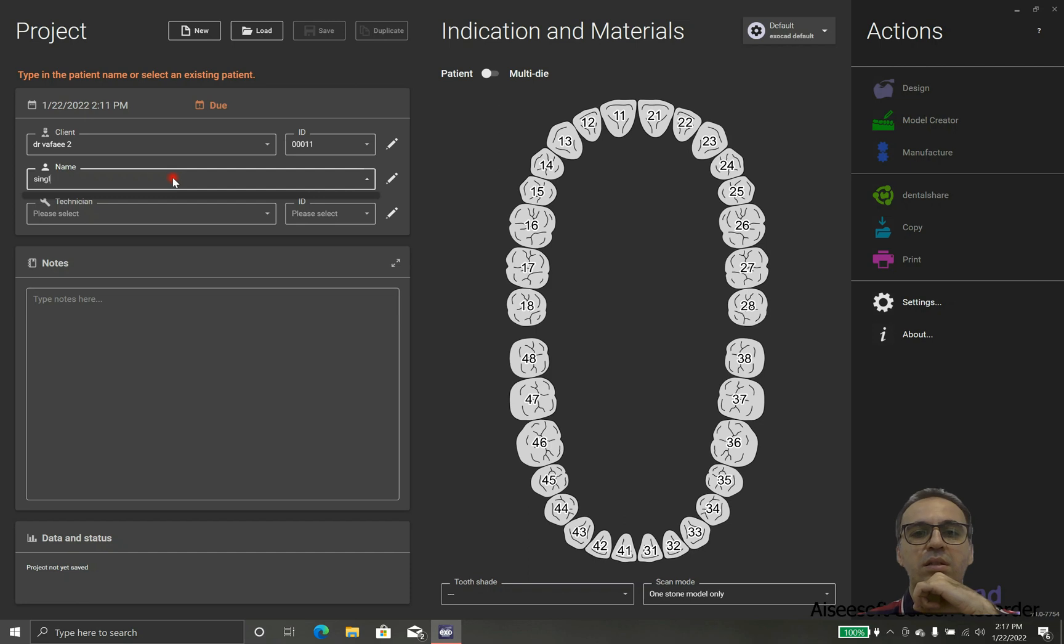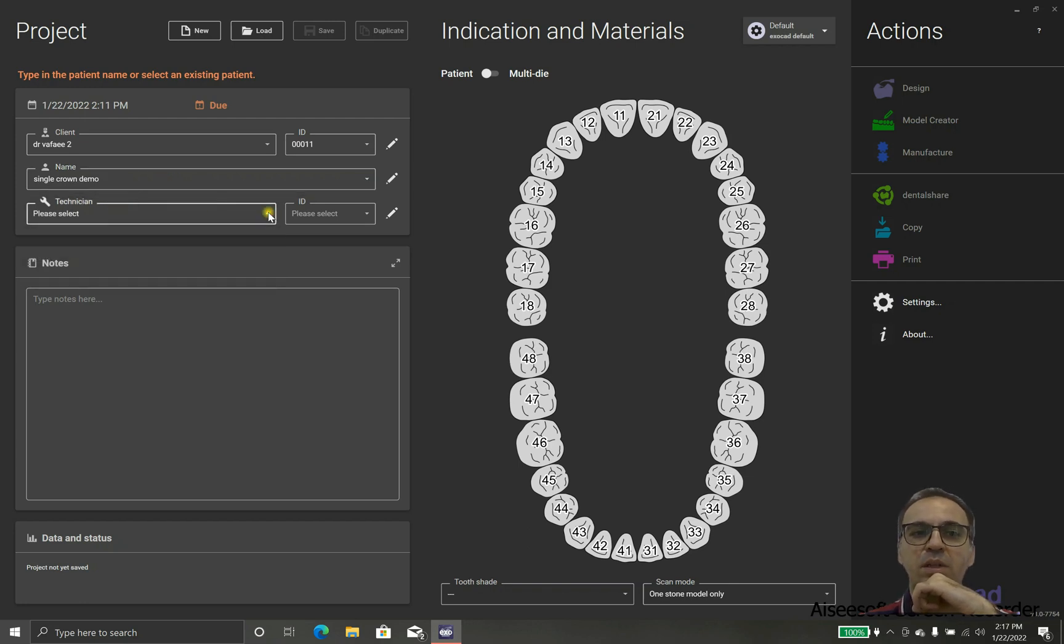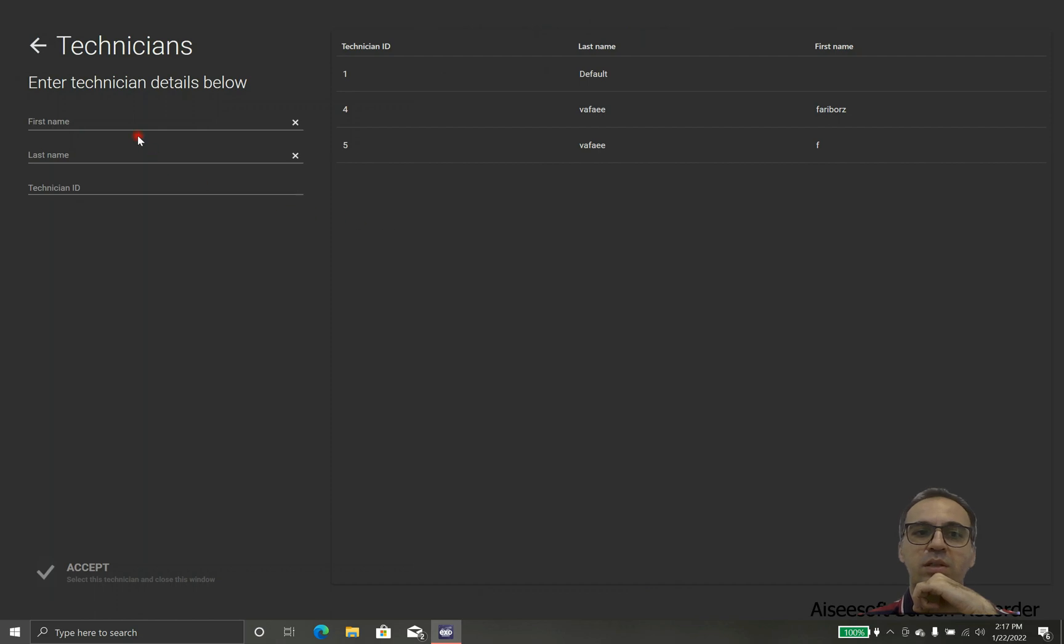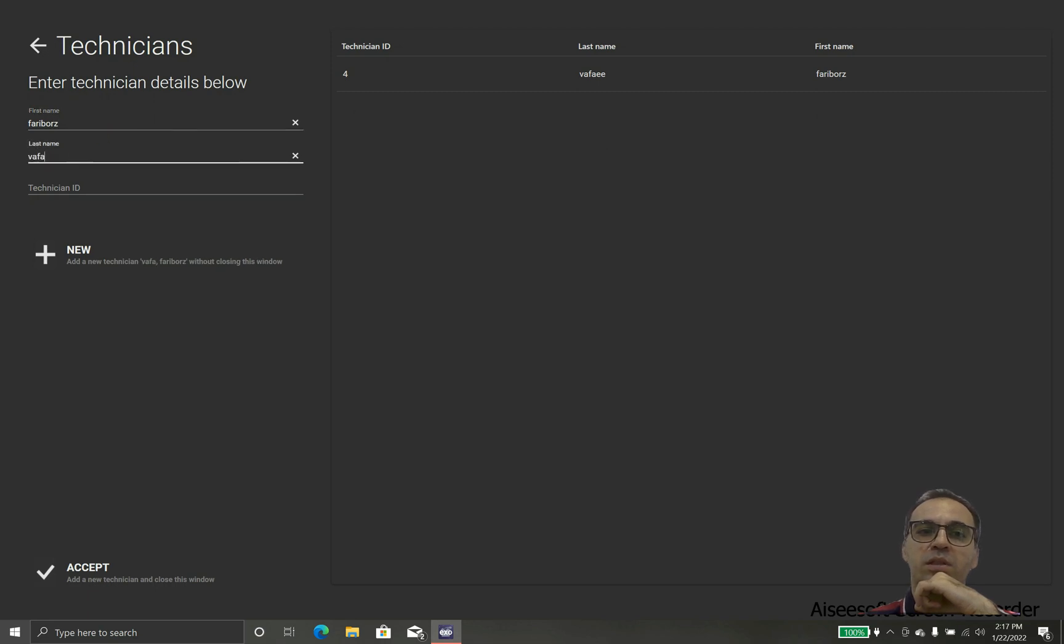The name refers to the patient or the case, whether the doctor sends the case with the name or with a reference number. In this case we are going to show single crown demo.